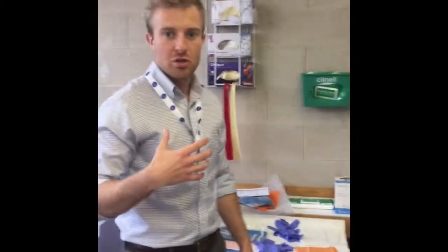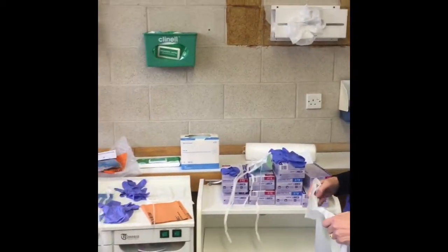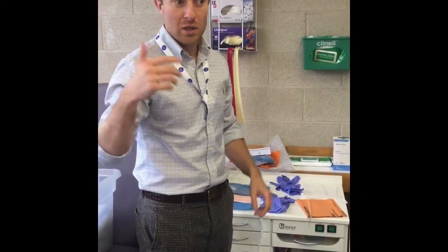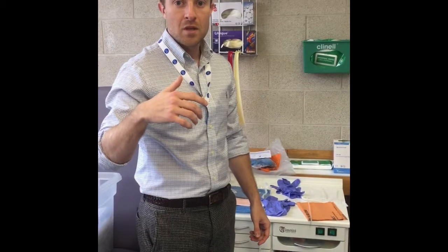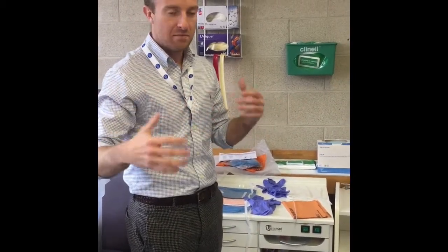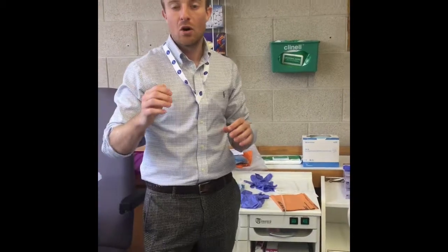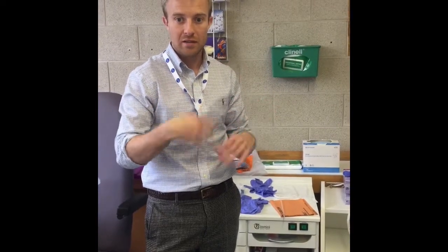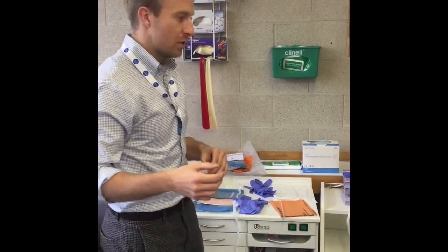So I'm going to play the role of the doctor, Sarah's going to be my buddy and we've got a patient that we spoke to on the phone earlier, got the history off and we've asked them to present via the side door. The buddy's job is to go outside in their semi-PPE, hold the door open for the patient, let them come in without touching anything and just sit in the chair, then get your examination done.